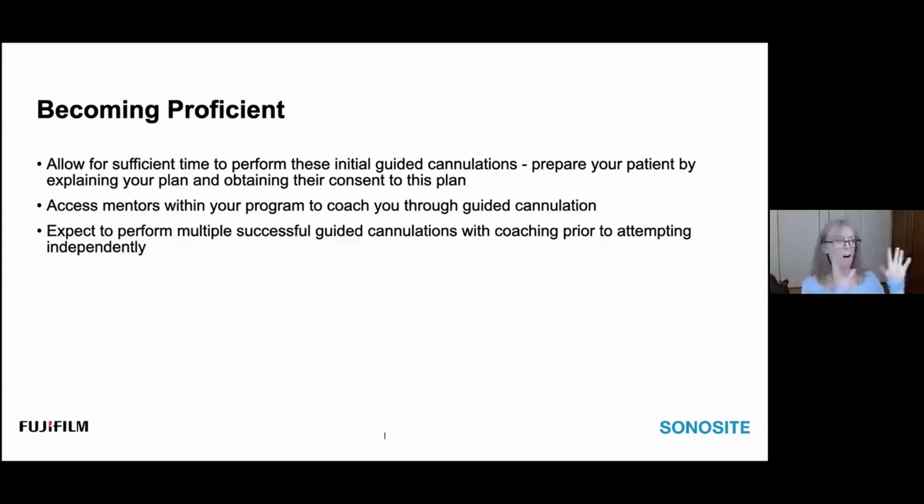You're the one operating all of the equipment, but you have somebody behind you who gently reminds you, okay, look up at the screen, now look down at the arm. Oh, you're drifting. You're not holding your arm still. The probe is moving across the arm. You've got to remember to hold that as still as possible. Coach gently. Don't bark out orders or reach over around somebody to press buttons.